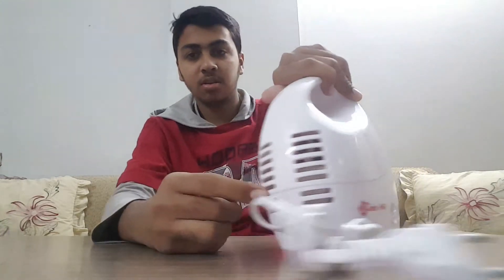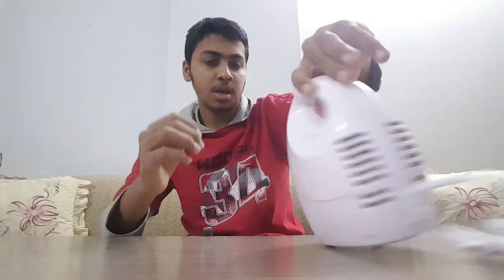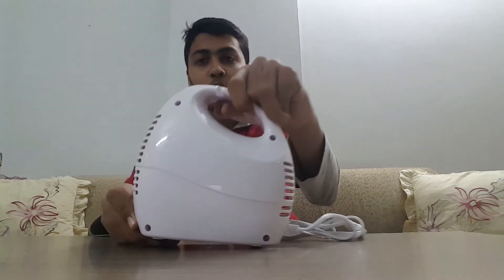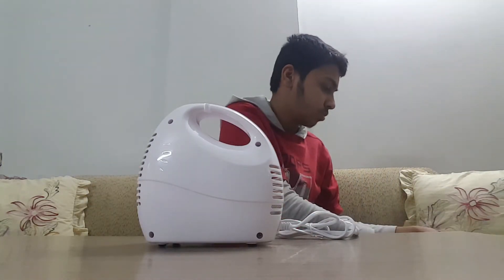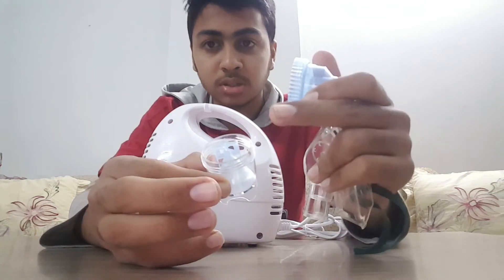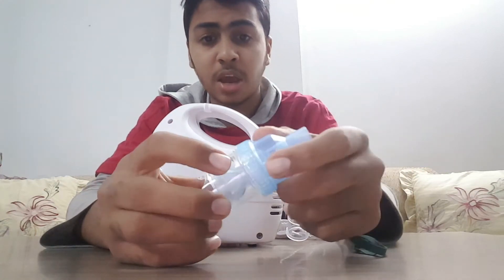On this side there is a fan which lets out heat, and on the front side there is the on and off button. For the mouthpiece, you insert whichever medicine the doctor recommends, then put the mouthpiece on tightly. Then you take the pipe — one end on this side of the machine.